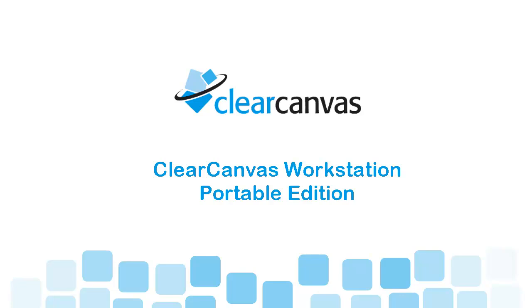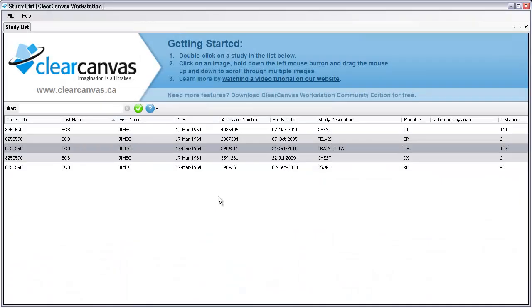Hi, my name is Jonathan and I'm a software developer at ClearCanvas. ClearCanvas Workstation Portable Edition is an easy to use image viewer that allows you to view the medical images on a CD, DVD or Blu-ray disc you just received. Using ClearCanvas Workstation Portable Edition is easy.